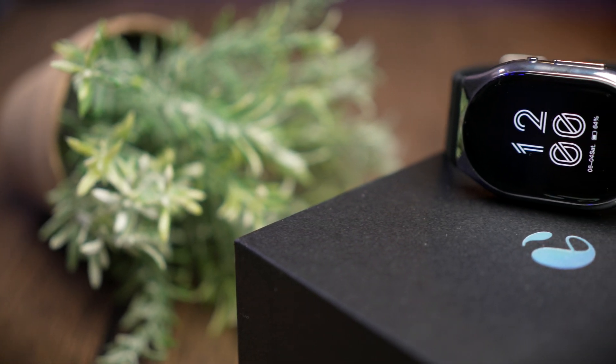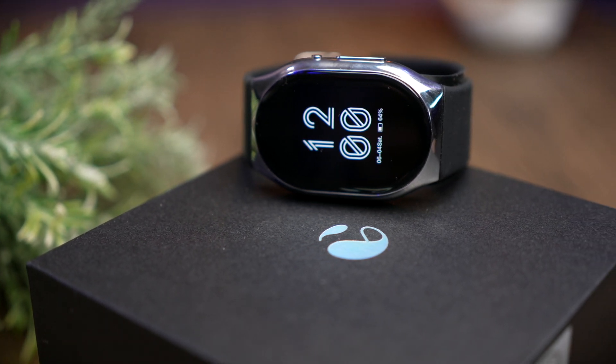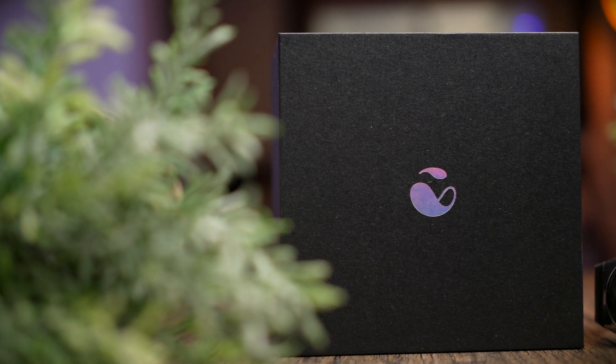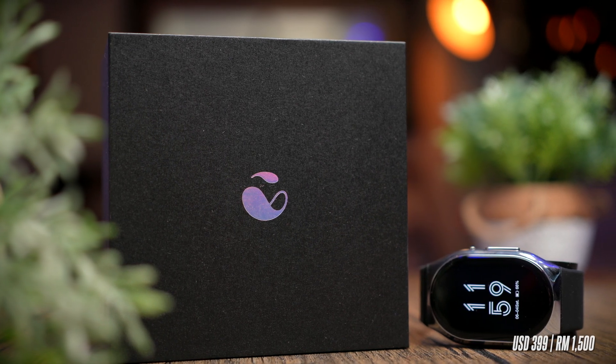This watch was sent to me by YHE for review and there was no money exchanging hands, so I'll be sharing my honest and unbiased opinion. The model I have here is the YHE BP Doctor Pro, which is their flagship model, retailing for $399 or about 1,500 Malaysian Ringgit.